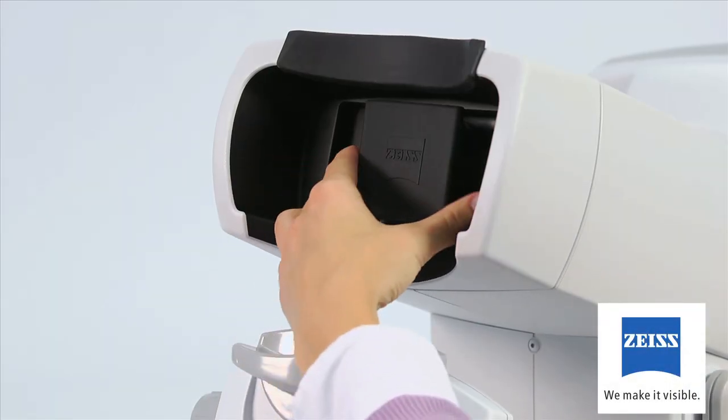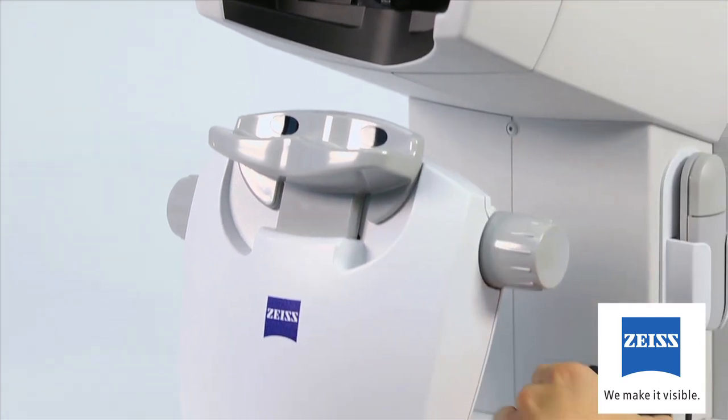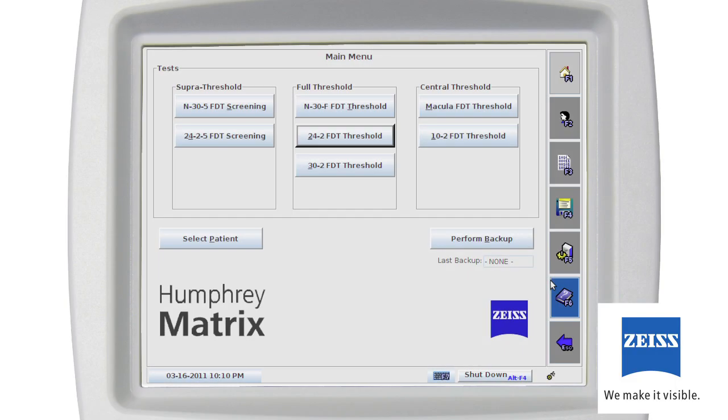When you're ready to conduct your first test of the day, remove the calibration cap from the patient eyepiece. Replace the calibration cap when the instrument isn't in use to minimize the accumulation of dust and debris on the eyepiece. To conduct a test, from the main menu, select the button for the test you want to perform or click the Select Patient button.